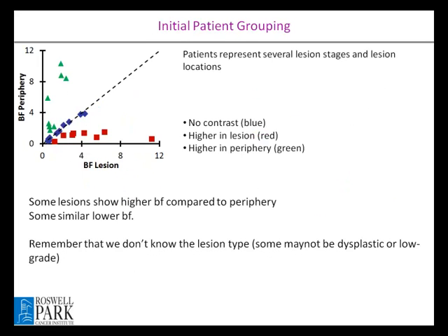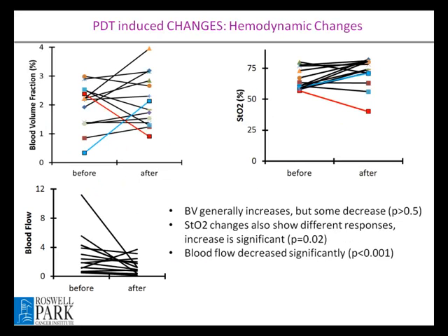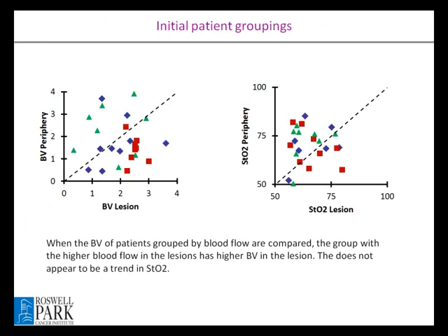And when we look at it, here is the correlation. In the blood volume, these red ones are where the blood flow was high. These two techniques are totally different, but whenever blood volume is high, we also see blood flow is high. So that is a good thing about having multiple-parameter investigation. For oxygen saturation, we don't see much of a trend, but we should also look at the oxy and deoxyhemoglobin as you are doing for the breast. We haven't looked at this yet.